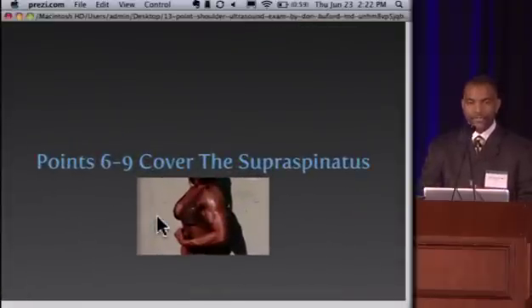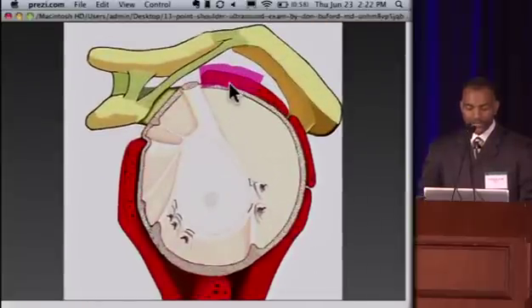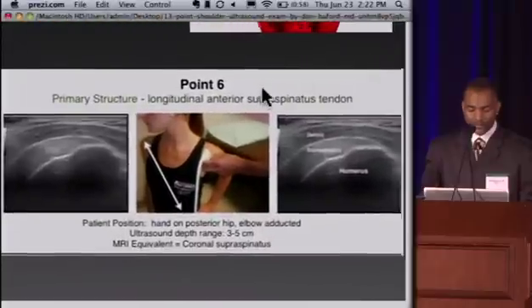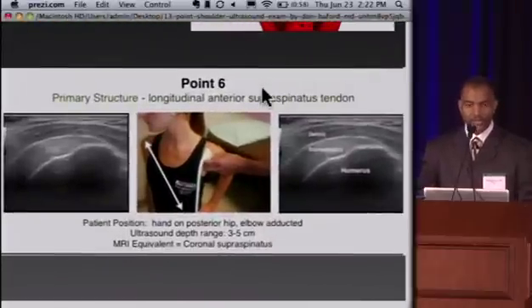That's the first five points covering the anterior shoulder. Points six, seven, eight, and nine cover just the supraspinatus tendon. We spend a lot of time on the supraspinatus because it's so important as shoulder surgeons to diagnose supraspinatus pathology. Points six and seven cover the anterior half of the supraspinatus, and points eight and nine cover the posterior half. Splitting the exam into multiple points lets us magnify the tendon and really fine-tune our diagnostic accuracy.